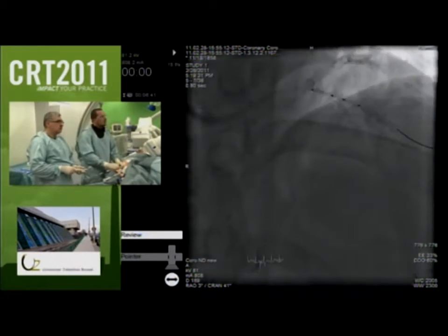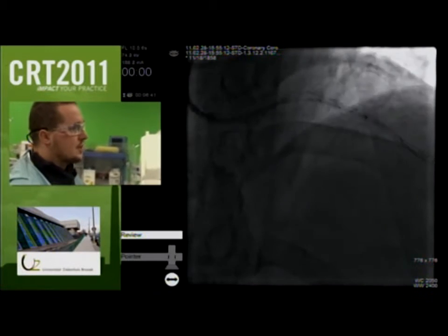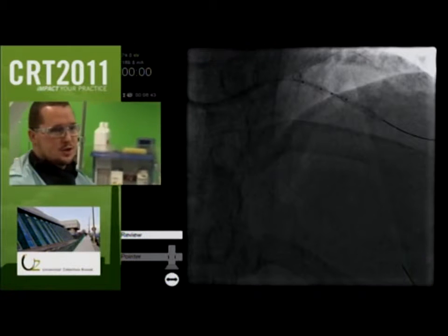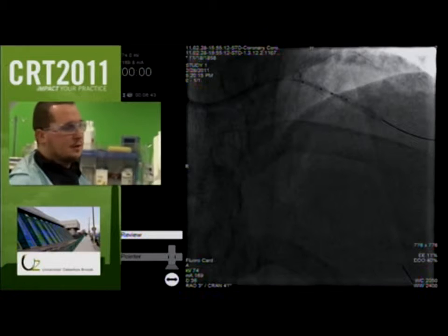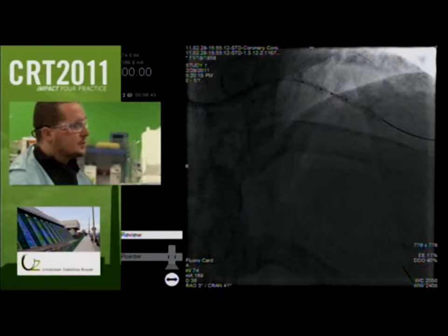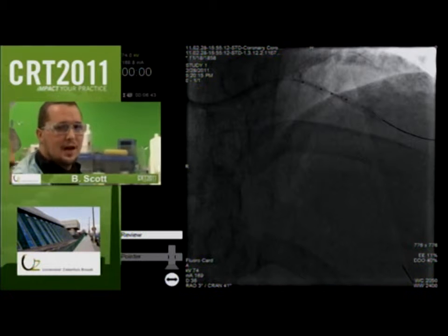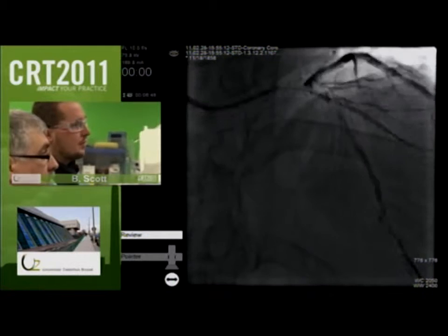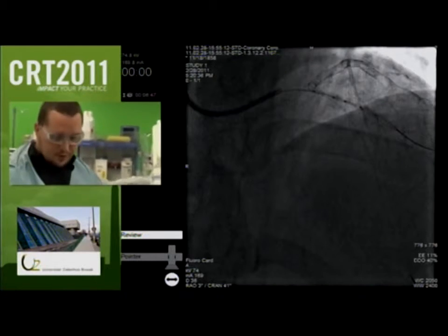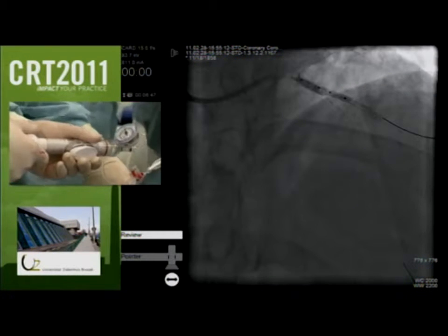Between the proximal 2 markers, you have the main vessel zone, which actually just consists of 3 struts and what they call a wedding band, which is just a proximal ring, 2 proximal rings now to keep it a little stronger, to minimize the amount of metal, but to stabilize your position while working anyway. So what we do is position the stent with the bifurcation itself in between the 2 central markers, and you actually have quite a lot of margin there. You have a transition zone of 5 millimeters, which is reasonably comfortable to position for you, and then we just deploy at 10 atmospheres.